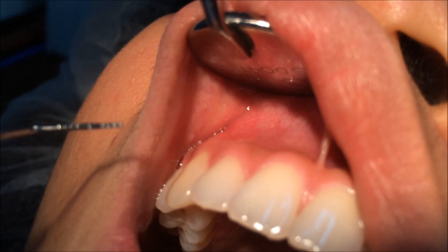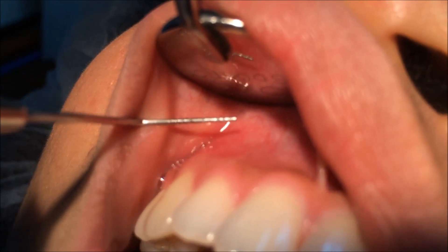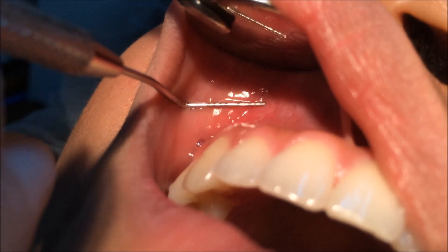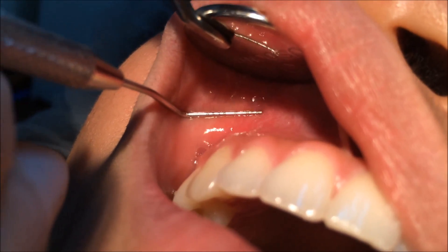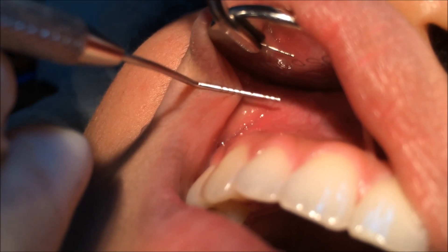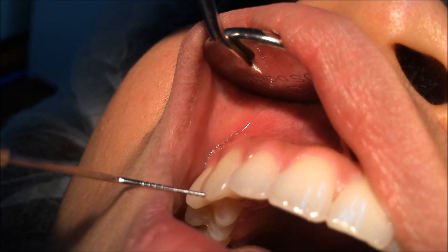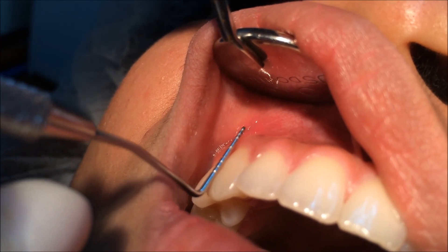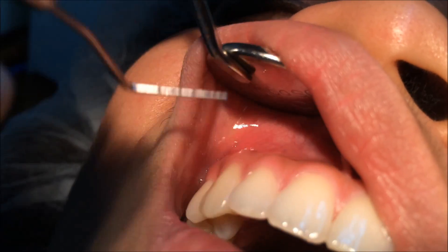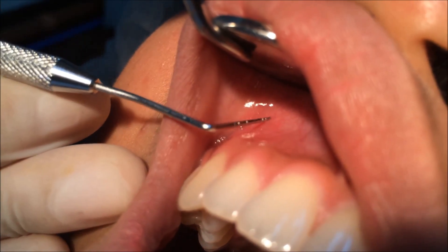The area of insertion is at the height of the mucobuccal fold above the apex of the tooth — shown here at tooth 1.3. This would be the area of needle insertion. The target area is the apical region of the tooth to be anesthetized. The landmarks are the mucobuccal fold, the crown of the tooth as a guideline, and the root contour of the tooth, which shows how the needle would be inserted in the proper position.